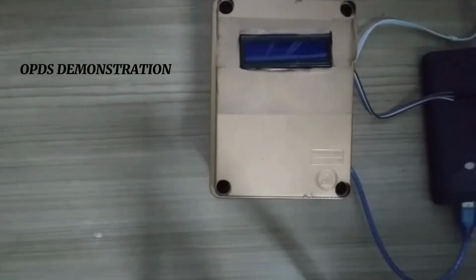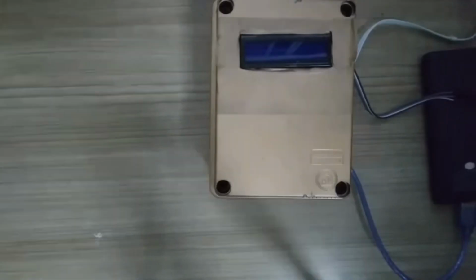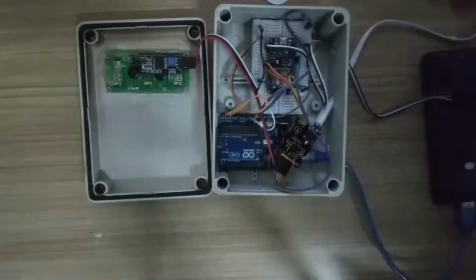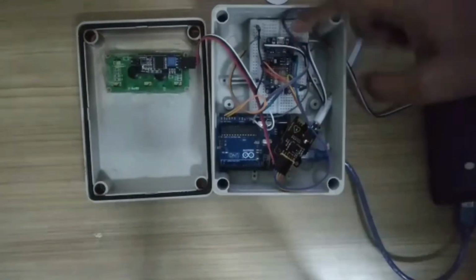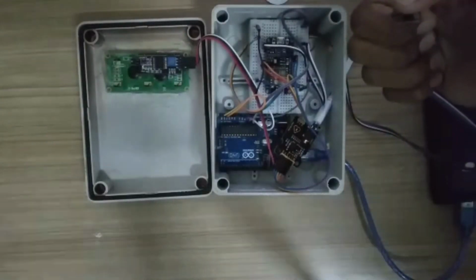Ladies and gentlemen, first we start on our components, the exterior components and the mental of our project here. First of all, we are using an Arduino Uno to monitor and correlate all the systems in this device together, which are the heart rate modules, ESP8266, LCD module, and our Oxy sensor.